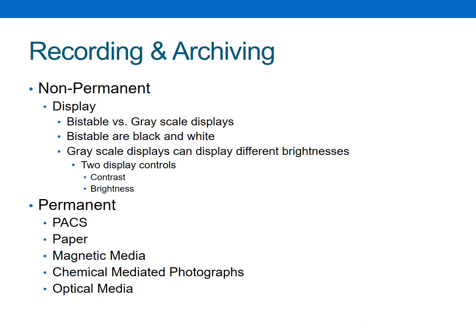We consider the display to be a non-permanent type of recording and archiving system. So we can see the information that the ultrasound machine has been processing now. So the display can either be a bistable, which is black or white, or we can have grayscale displays. Most modern equipment now is a grayscale display.